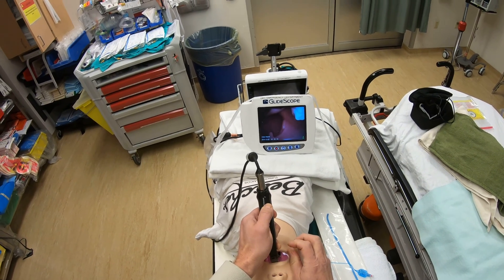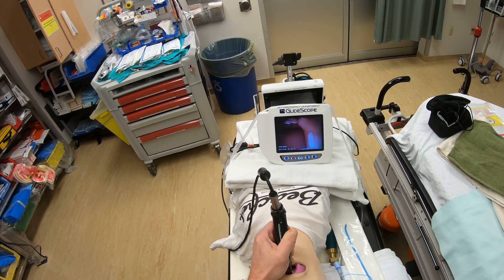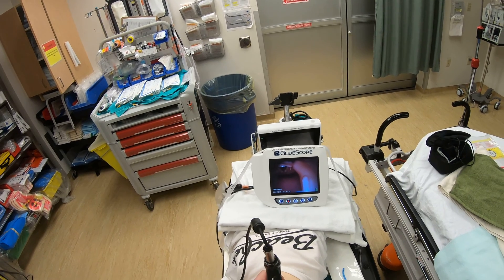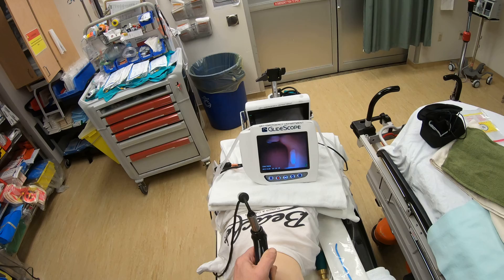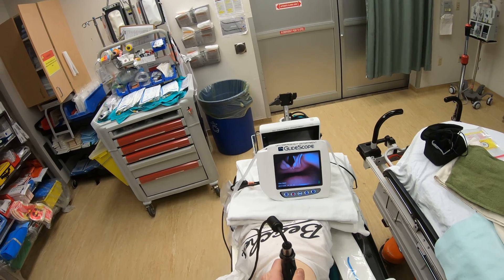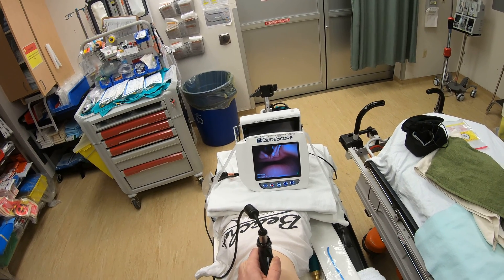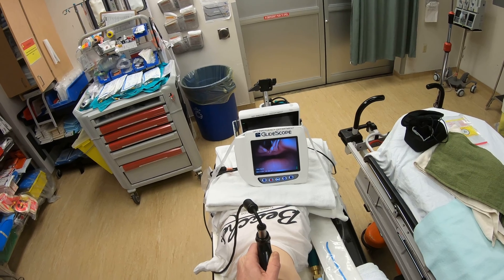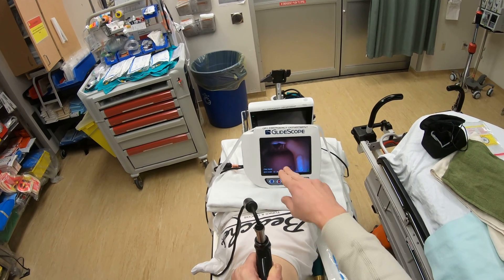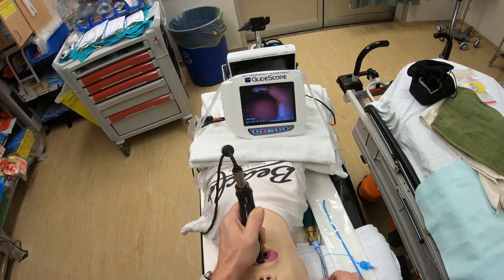Then you're going to do epiglottoscopy — slowly walking down looking for the epiglottis. You're going to get into the vallecula and get this kind of view. It's a bit dark, but that's the view that you want. It's counterintuitive, because a lot of people think a more open view is better. The problem with that is you're looking up to the anterior tracheal wall, which means you have to manage two curves. So we deliberately use a restricted view — we describe it as a 50-50 view: 50% of the glottic opening and 50% of the screen real estate.